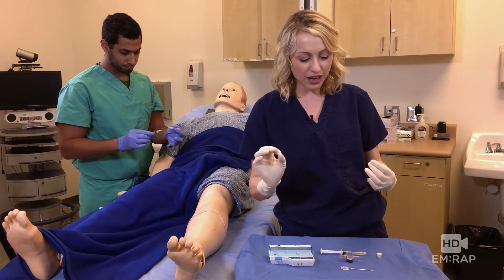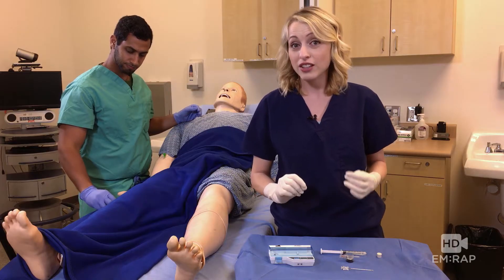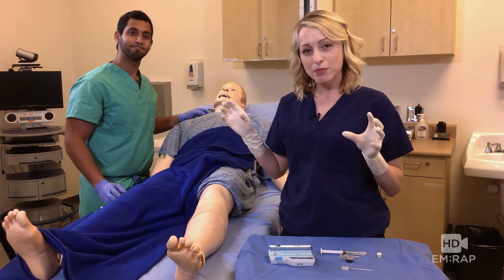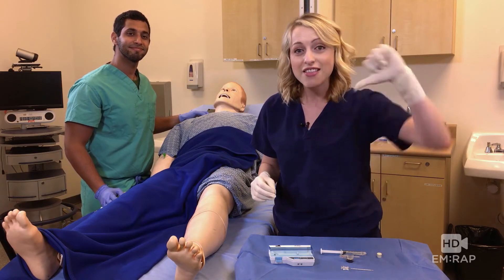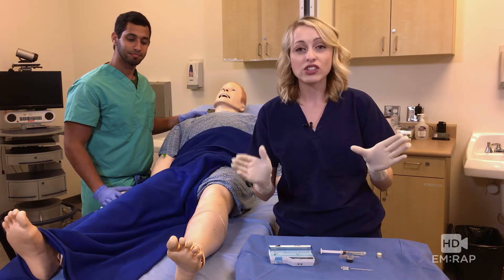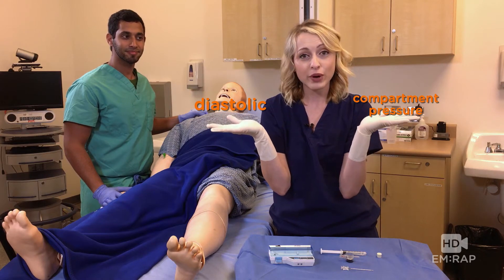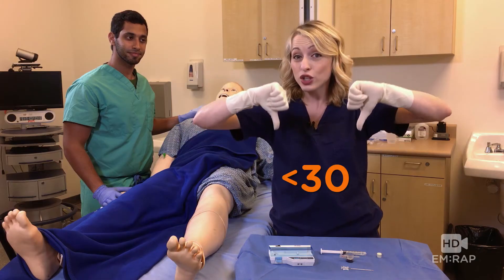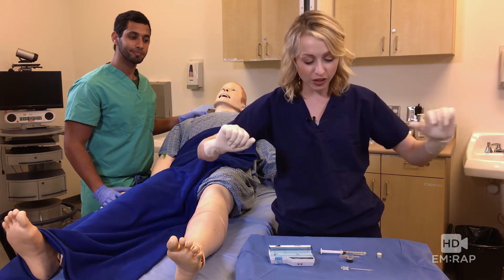There's one thing you need to remember before you start and that's the number 30. That's right — if the pressure in any compartment is above 30, that's bad. Also, if the delta pressure, which is the difference between the diastolic blood pressure and the compartment pressure, if the difference between those is less than 30, also bad. Now let's get started.